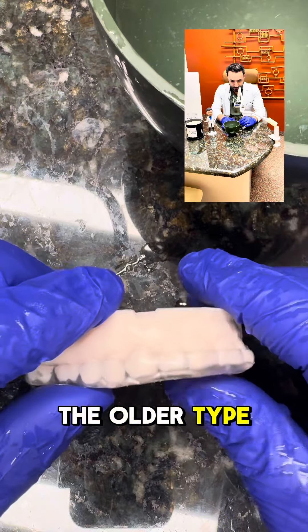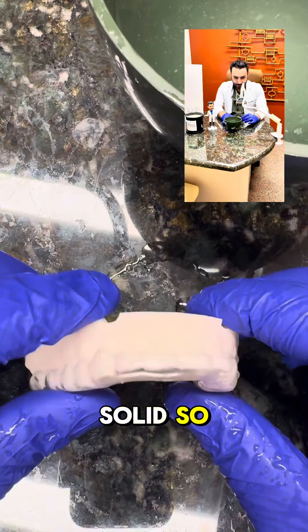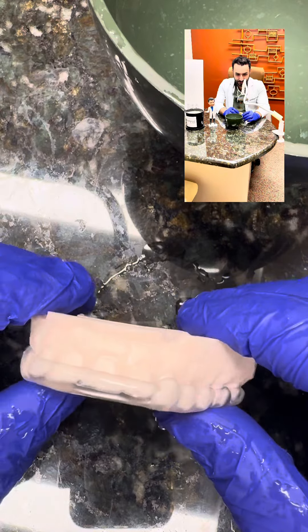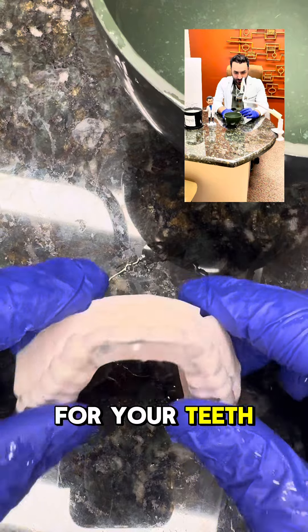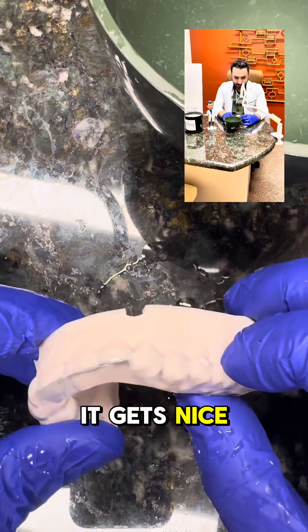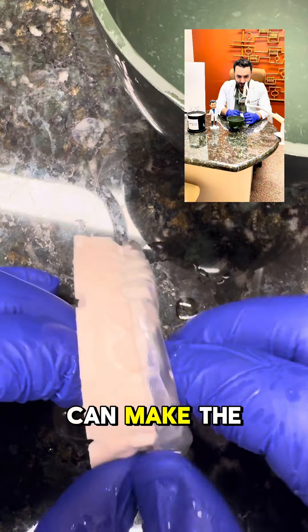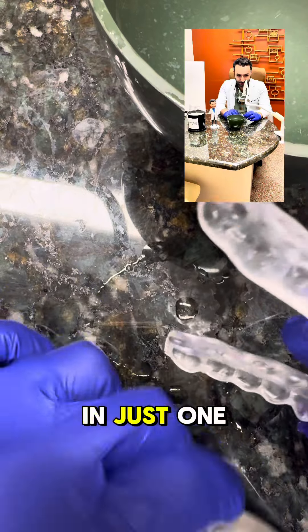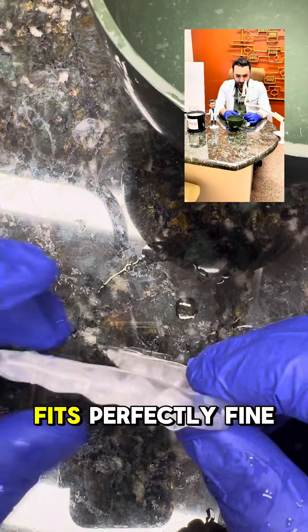The older type of night guards were just solid, so you had to come back for multiple adjustments to make sure it was a good fit for your bite and your teeth. But with this new type of night guard, it gets nice and solid when it's not hot. We can make the adjustments as I showed you in the video in just one minute, and when you go home, you're sure that the night guard fits perfectly fine.